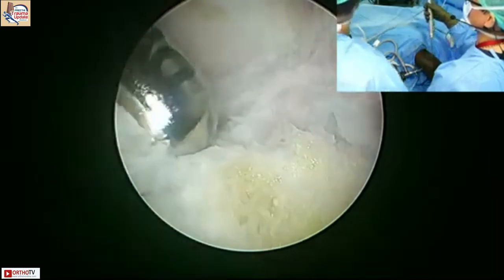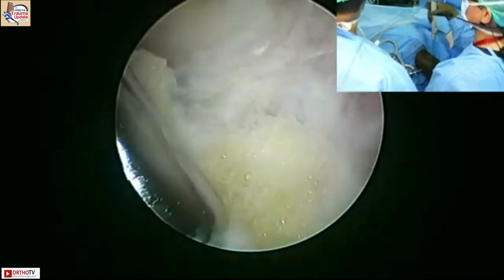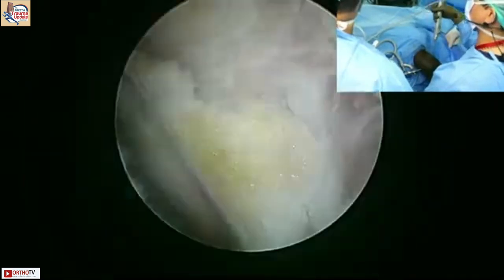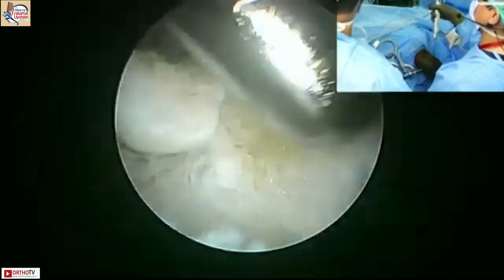Unless you have a very good inflow and you're constantly irrigating, and then maybe yes. Very rarely we use it for scapholunate tightening. For the wrist, there is a small radio frequency probe. The wand is there. It's malleable, the probe, so you can just go exactly where you want. It's not a rigid probe. So then you can use it.